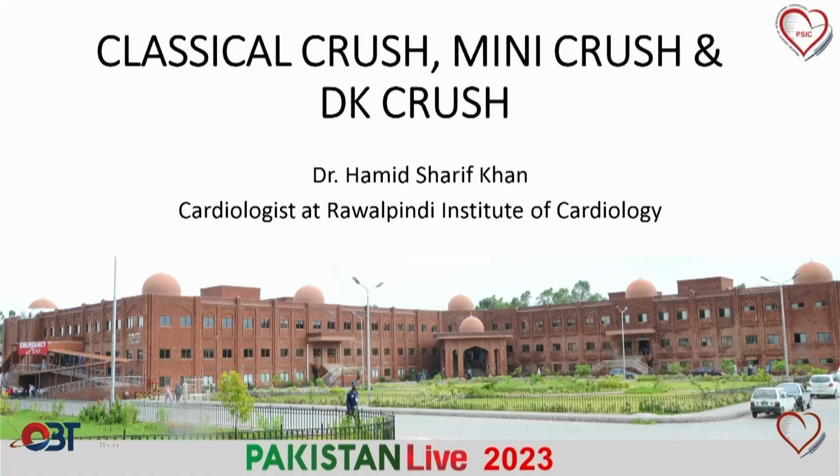About the crush. As you all know, we have evolved over a period of time with the crush technique, starting from the classical crush, then nano and mini crush, and there is also DK crush, which has a very robust data behind it, a lot of positive data. DK crush is one of the standard treatments of choice when it comes to upfront two-stent strategies.